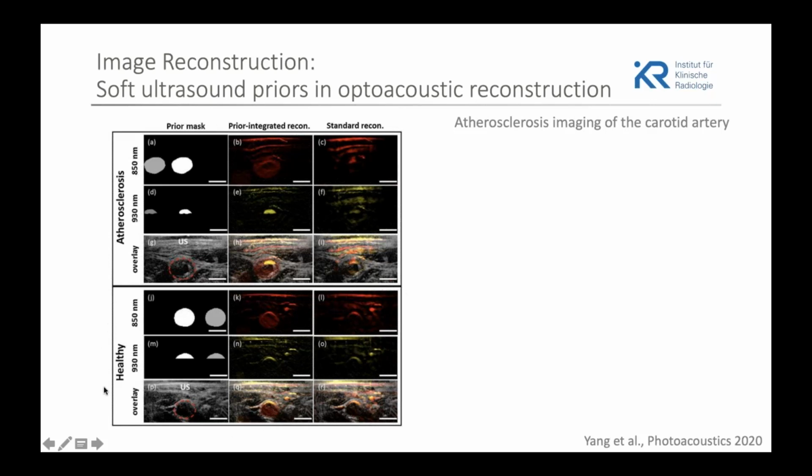Importantly, as shown here for healthy volunteers, the reconstruction method does not produce false positive results for the plaques. This looks mainly the same here in healthy volunteers not having any plaque, like the patient above here.